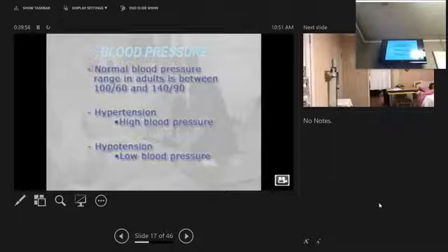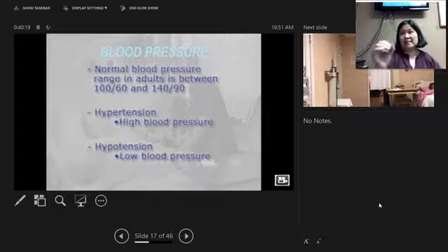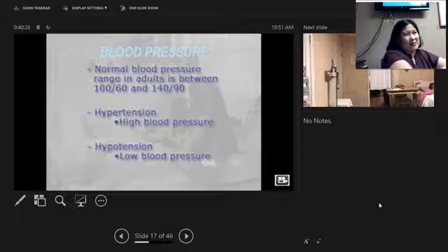Your radial pulse is on your thumb side, but your brachial pulse comes up the middle and then into the pinky side. Where your arm bends is your antecubital space, and everybody can feel their own pulse. You can just find it where the bend of the arm is, and then on the inner aspect. The bell diaphragm of your stethoscope is a big, huge circle. It's going to cover the majority of the area, even if you can't feel it so well.